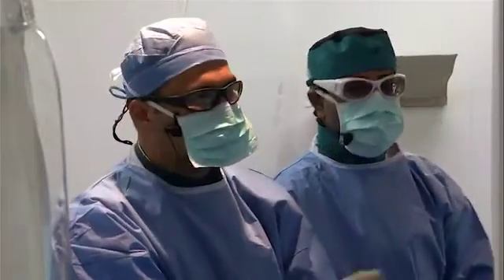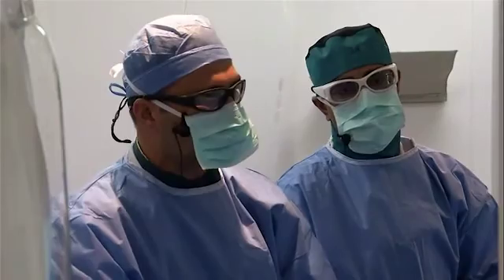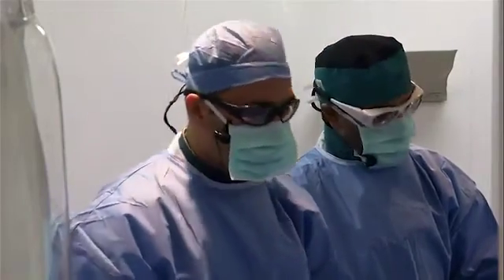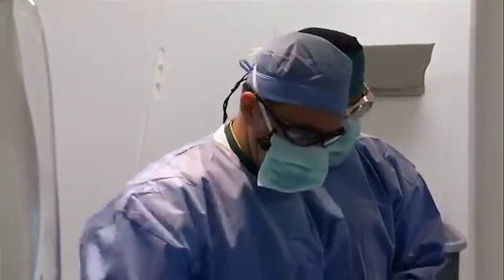Our approach right now is that we're going to try to cross this lesion while you guys discuss the case and give us some advice related to the AV fistula and what we should do. So I'm going to go down the panel, from my right all the way in, using what you just said in the prior presentations: your strategy and the factors that would contribute towards deciding on the strategy itself.